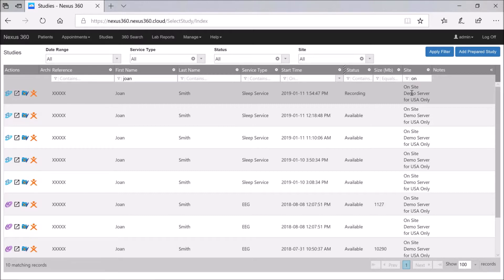What we want to do now is open the data in Profusion PSG whilst this recording is still going. The way this works is: if you're off-site and somebody says they saw some events recorded and asks you to log on and have a look, this gives you the ability to do that. It will not allow live streaming of the new acquisition — what it does is open it up at a point in time, so you can backtrack through everything recorded up until the moment you opened it.